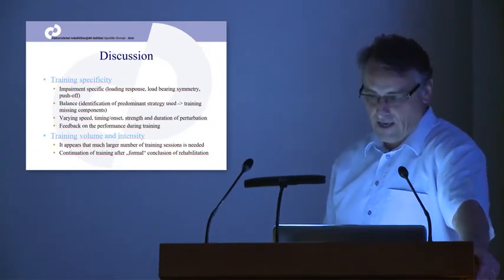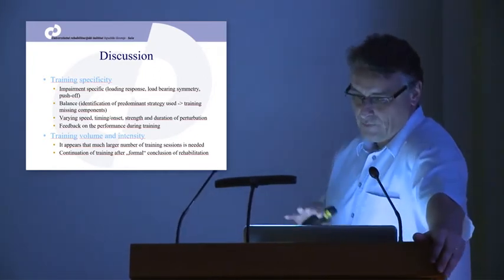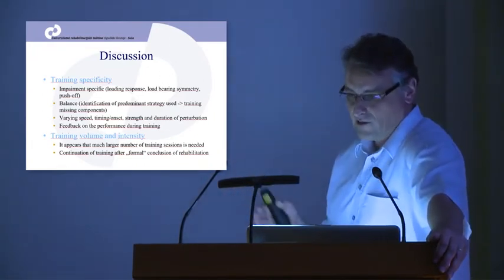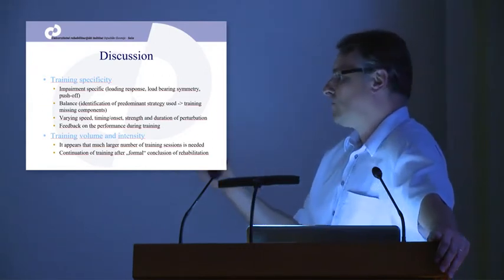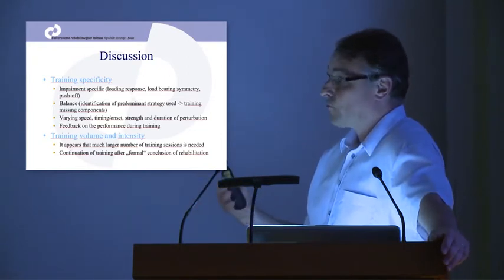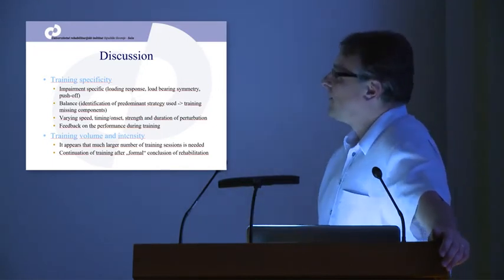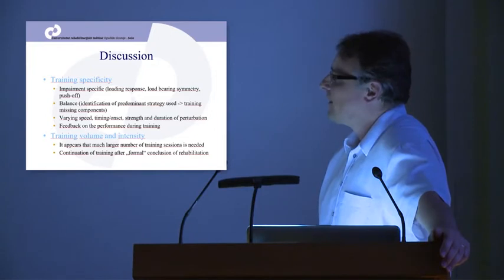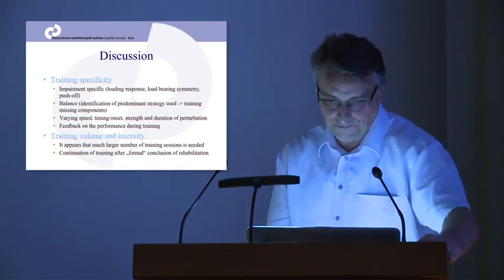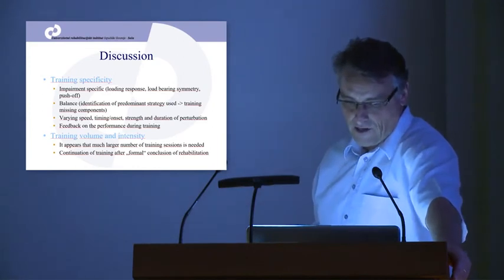counteracting perturbations. What also was found quite important was that the speed of walking where we perform this kind of training needs to be sufficiently slow, even though we know that walking at slow speeds is far more challenging than walking at higher speeds. But if we want to train these abilities at higher speeds, then you would not be able to concentrate on what is important. Feedback on the performance during training is absolutely necessary.